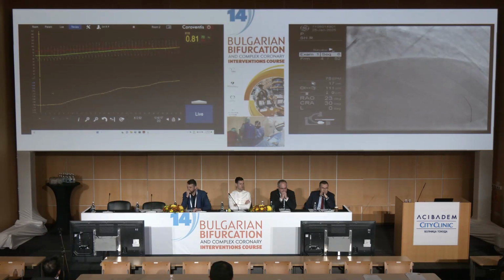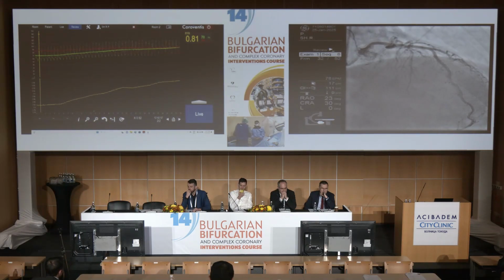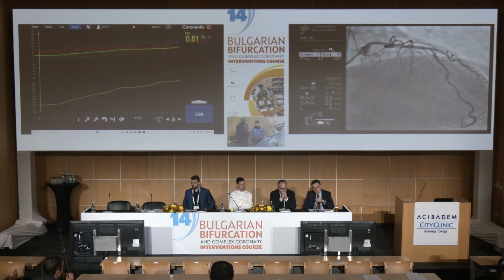It shows a very progressive disappearance of the gradient from the very distal LAD to the proximal left main. So it is not per se this ostial lesion which is the problem, but it is probably this diffuse infiltration of the coronary artery which is responsible for a small pressure gradient.